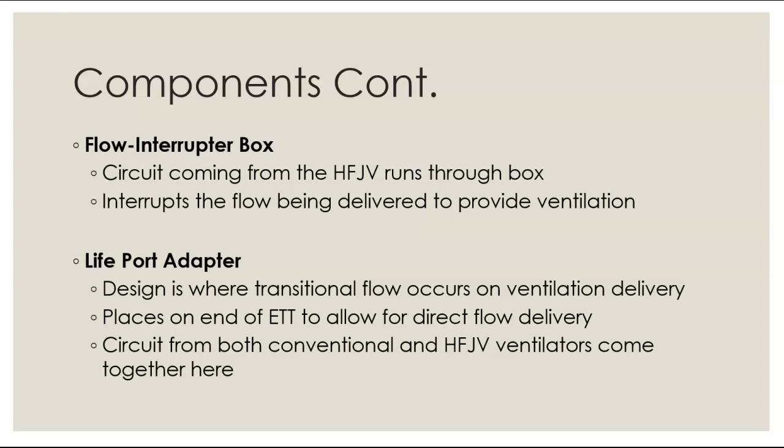So how we combine these two ventilator circuits is the jet runs through this flow interrupter box, and then it connects at a specialty port called the life port adapter. So this circuit coming from the high frequency jet ventilator runs through this box, interrupts the flow being provided for ventilation. I also have pictures of these coming up.